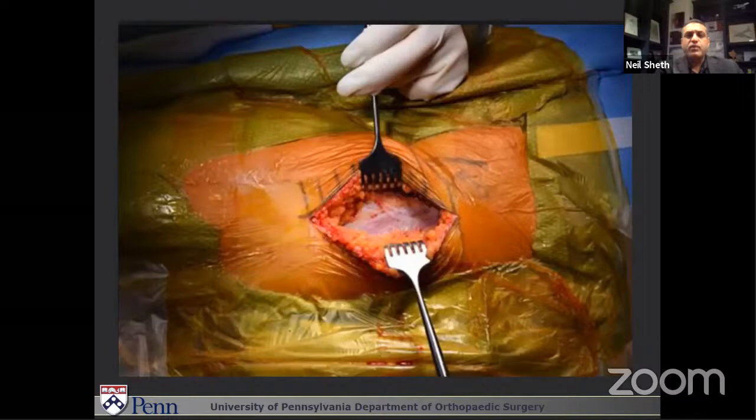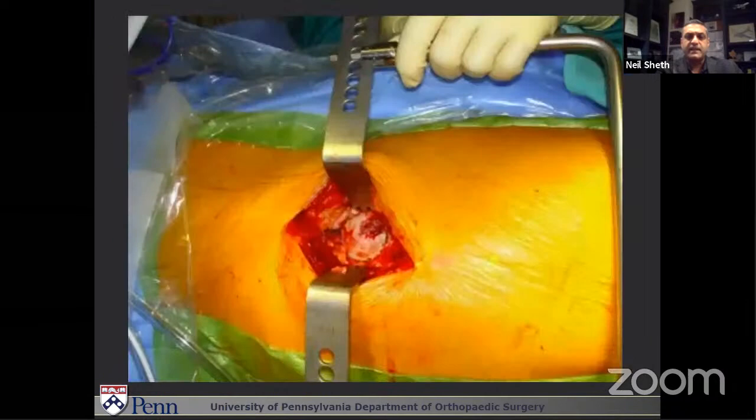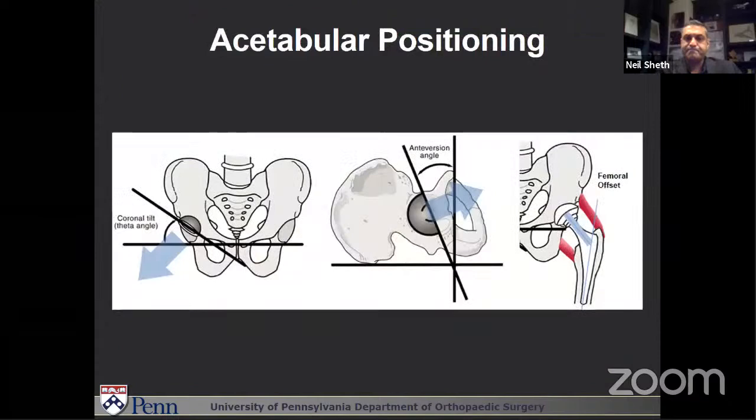The hard parts for me were doing the exposure and getting comfortable with what I was seeing in the position I'd be seeing it. Next was the acetabular exposure — everyone said it is excellent, and I agree it is — but the orientation is 90 degrees off from what I'm used to seeing. Acetabular positioning was different: raising your hand is anteversion as opposed to potentially being abduction in the posterior approach and vice versa.